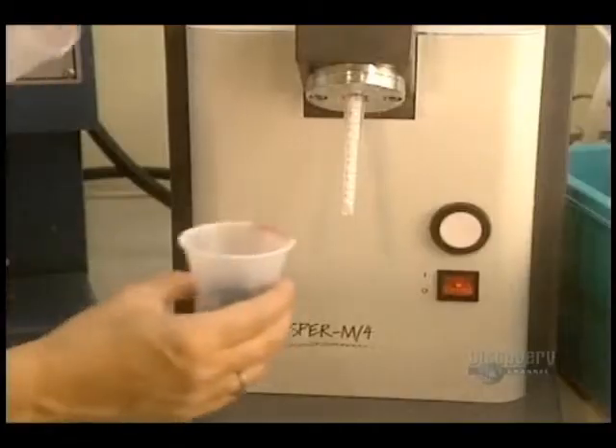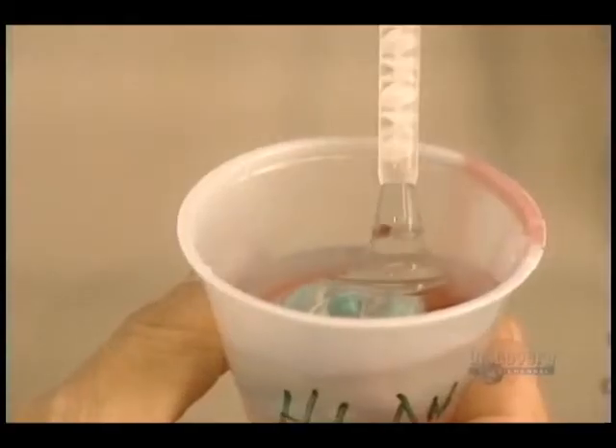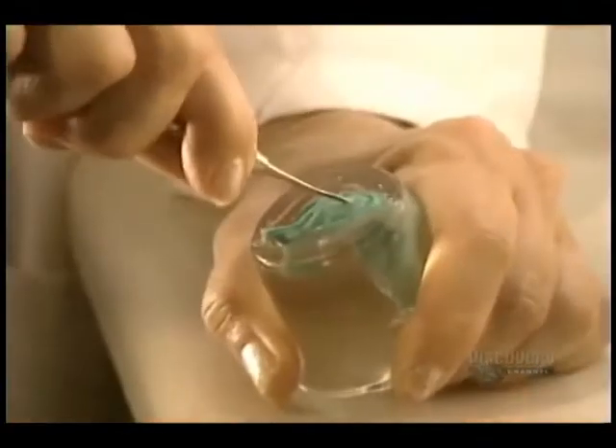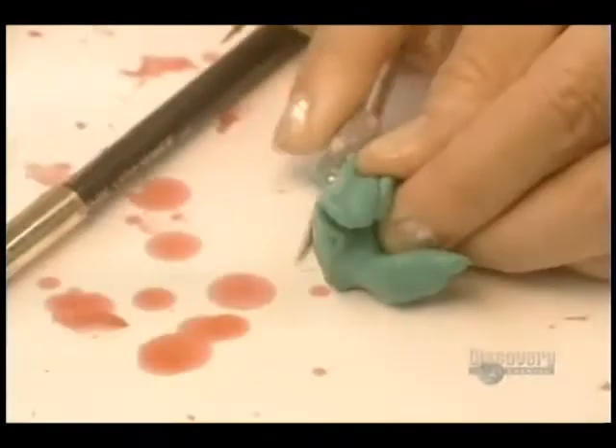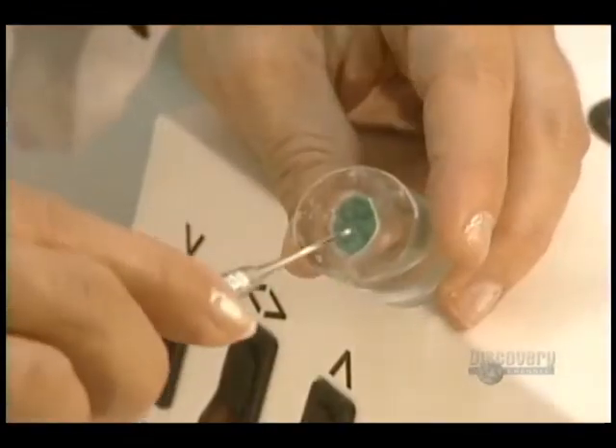Then the silicone container is filled. The silicone hardens in only 10 minutes. The hardened silicone block is removed and the excess of the imprint is removed so that only the essential part is retained. The imprint must slip easily into the ear.